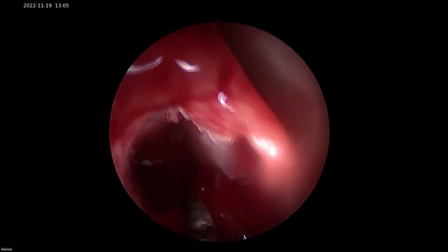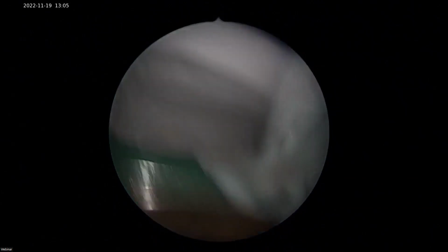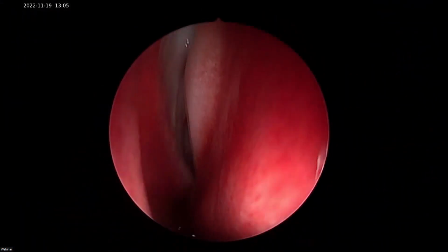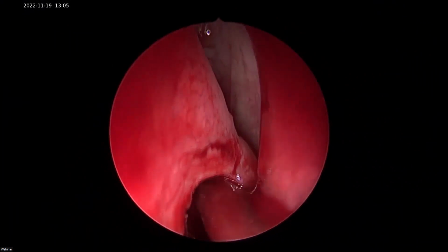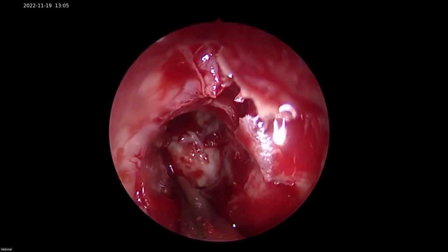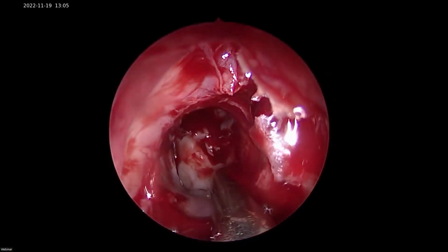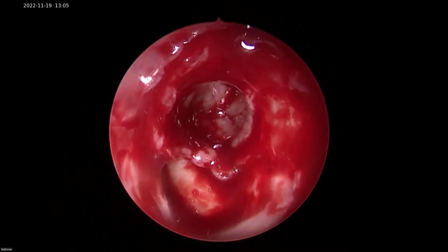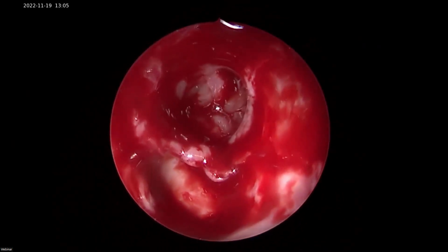So, 70 or 45? 70. Give suction. I'm falling a little short. Maybe because of the deviated septum, I don't have good space, but otherwise the frontal has been opened up. Okay, as you have seen, this side frontal is very small.